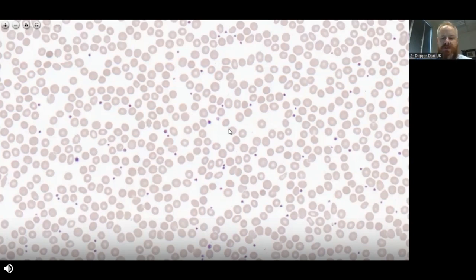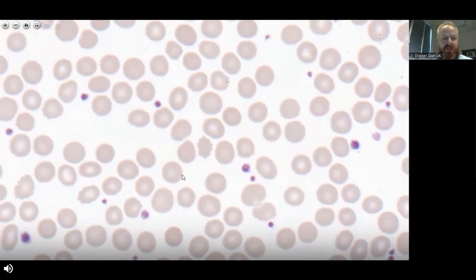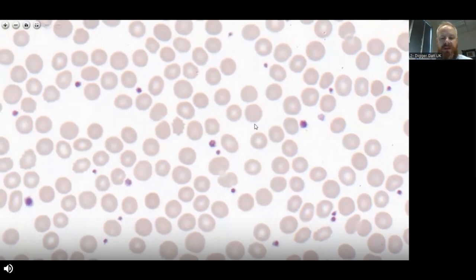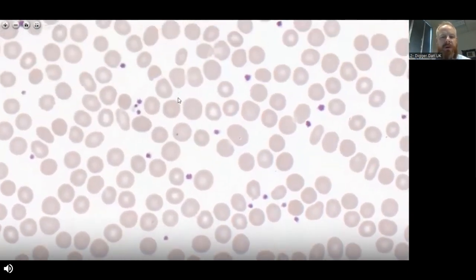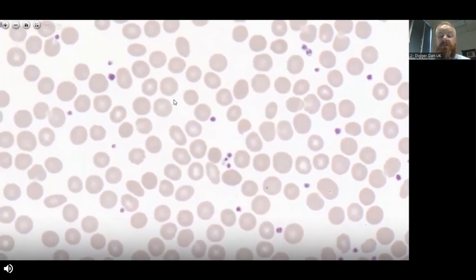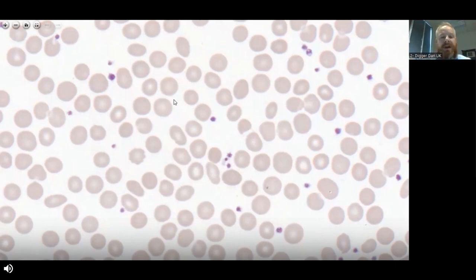Let's think more about the structure of the platelet — why does it appear as it does? If we zoom in, we can see that the platelet has a central purple area that looks a little bit granular, and a slightly pale halo ring around it with a blue appearance. The inner area that stains purple-red using a standard Romanowsky stain is known as the granulomere or chromomere. The area around the platelet that looks slightly more pale and blue is known as the hyalomere.